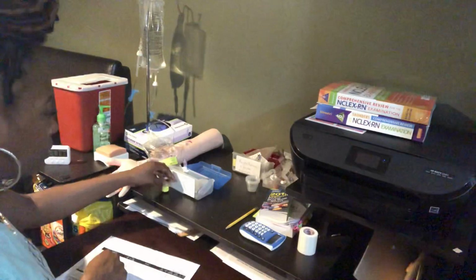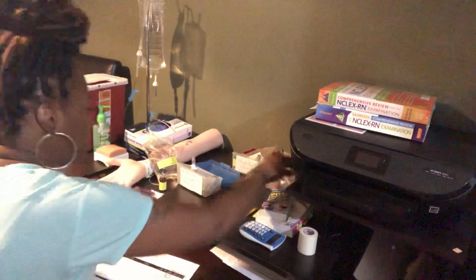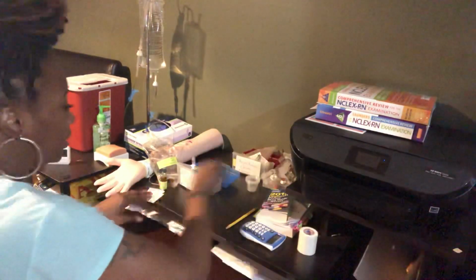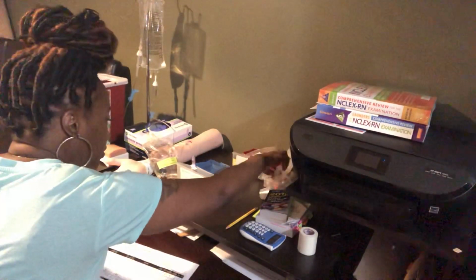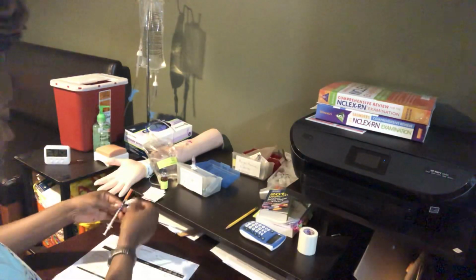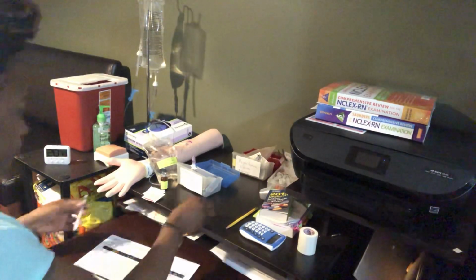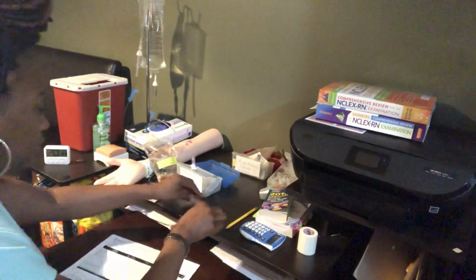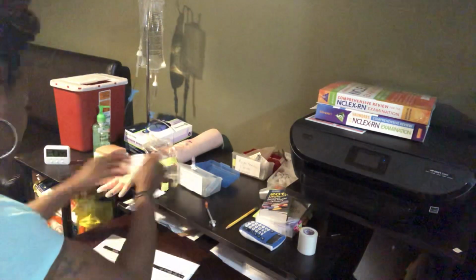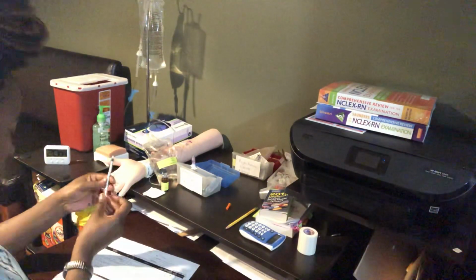I'm going to go ahead and prepare my regular insulin. So I know I need alcohol wipes, 1 to wipe the skin, and 1 to apply the pressure. I need a needle. And there we have it. So I am going to clean the vial. I am going to put 10 units of air in there.